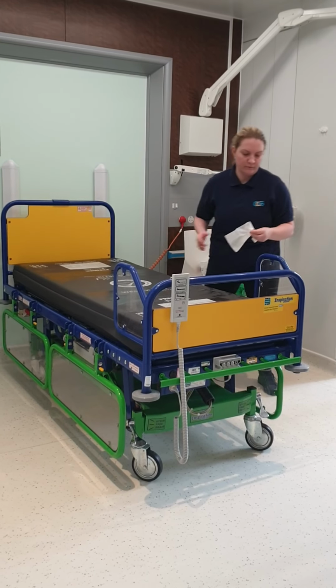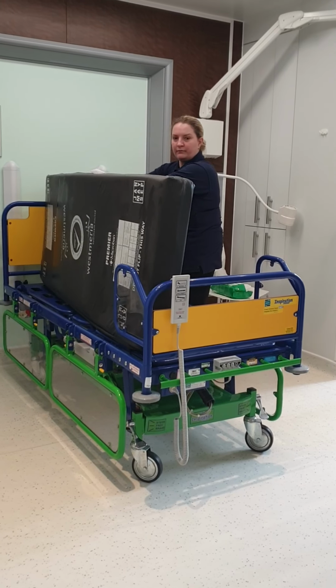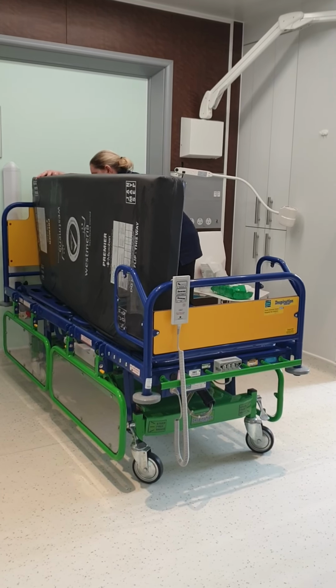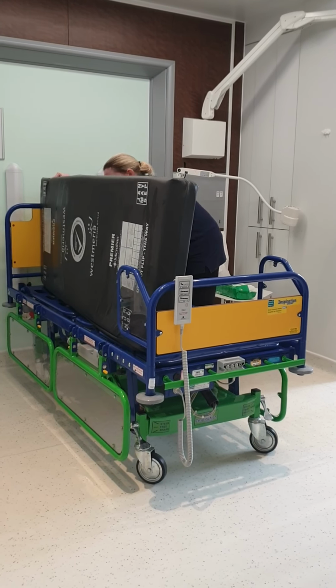Surfaces like beds are often very complicated things to clean. You need to think of it as splitting the surface up into different sections to enable efficient cleaning to be undertaken.